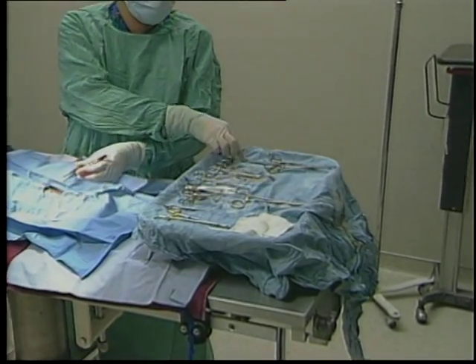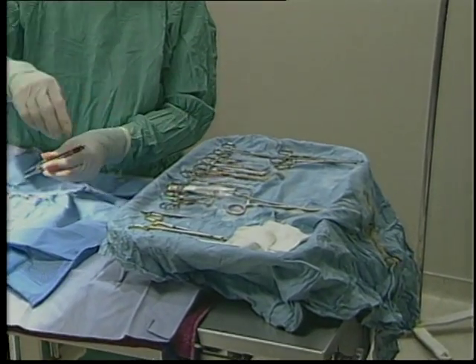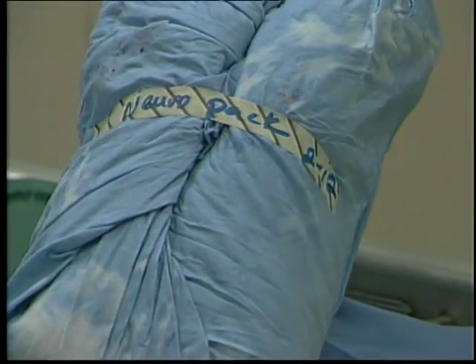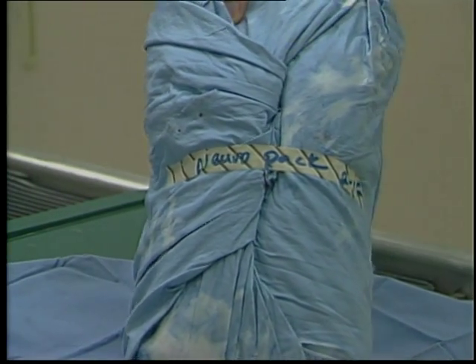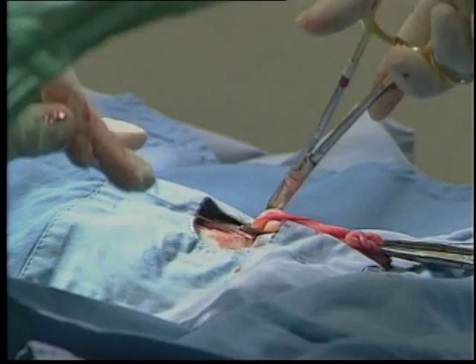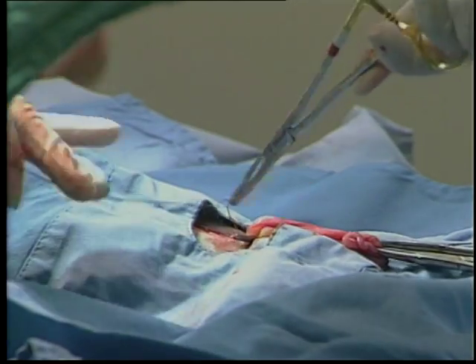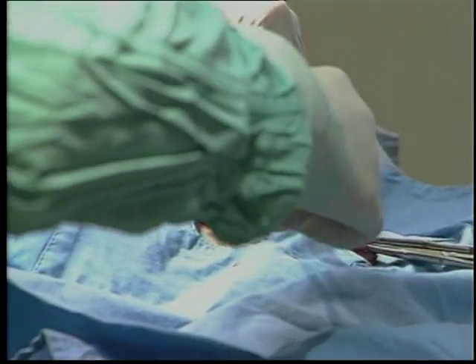The instruments just discussed are some of the most commonly encountered instruments in the veterinary surgery pack. You should familiarize yourself with others that are present in your doctor's packs. Most veterinary hospitals will have various surgery packs containing just the needed instruments for various types of surgeries. Your familiarity with surgical instruments will not only make you an asset to the veterinary surgeon as you assist in surgery and surgical preparations, but it will also make the job more interesting as you come to understand the way each instrument is used for its specific purpose.